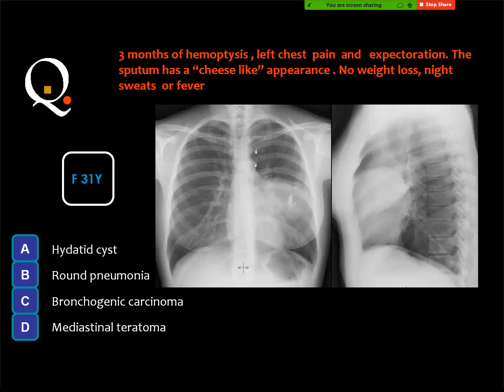Doctor, if I find atelectatic bands on the CT, do I write it, and is it significant for the referrer? No, and I have mentioned many times to the clinicians, do not look for any sentence mentioning atelectatic bands.